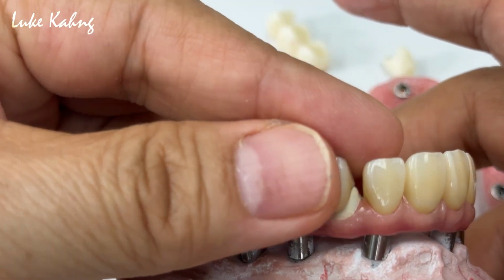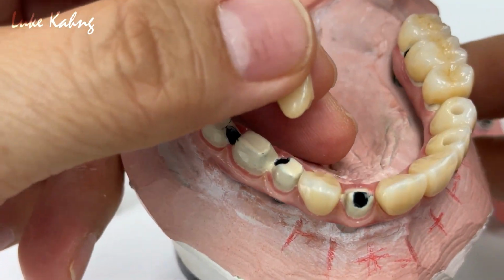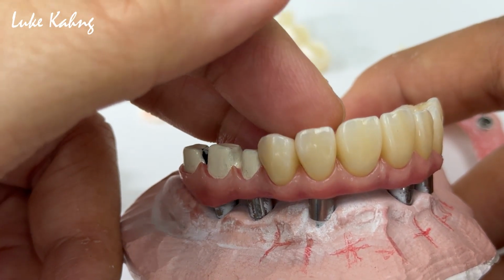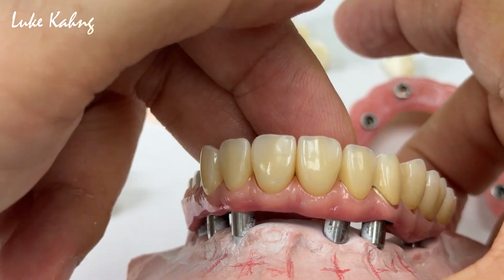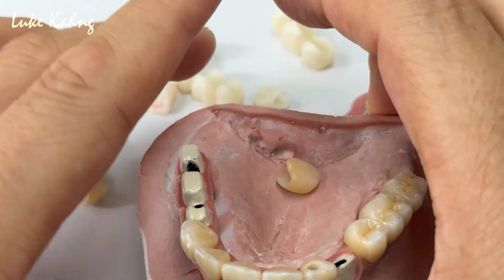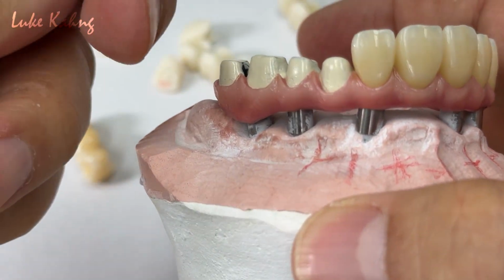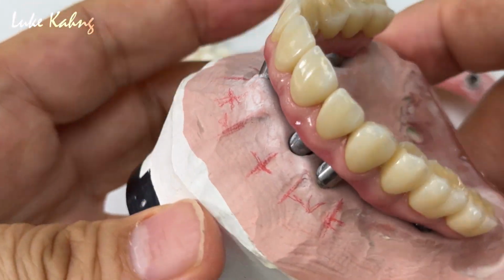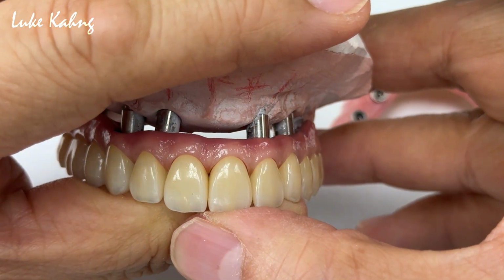And a different thing here, doctor, we're going to put the cement in that area. So we're not going to cement here. Okay, so we'll cement individually here. This, we cemented. Except that it's lateral. And 3-unit bridge also. This is the final work. It's another beautiful case. It's like that.